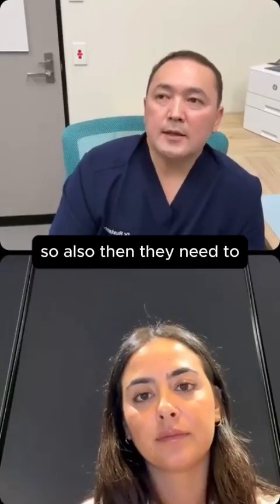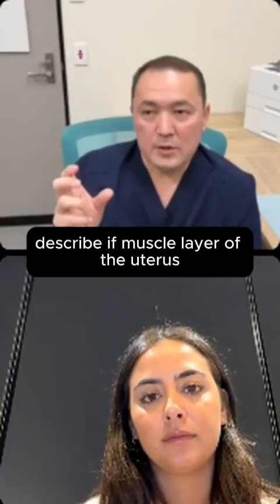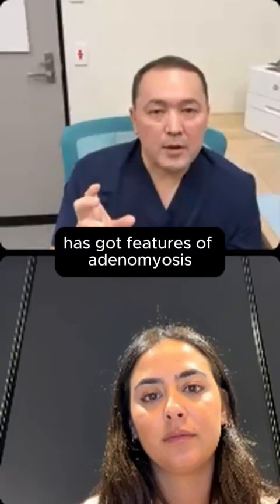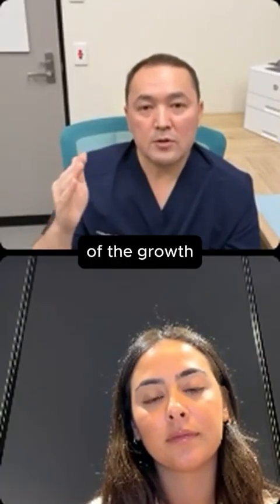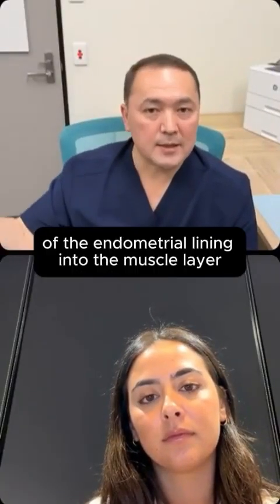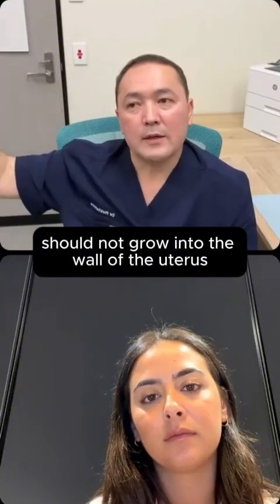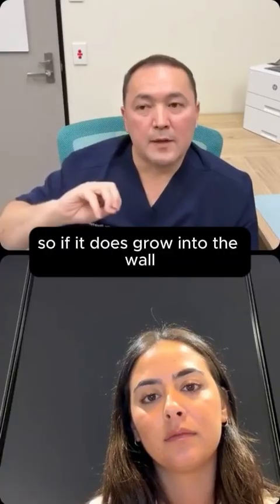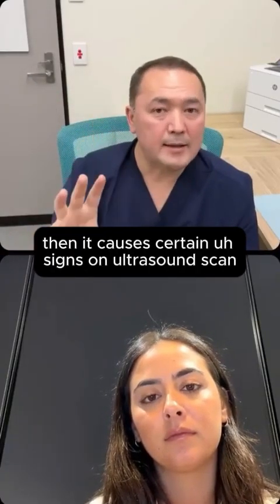So also then they need to describe if the muscle layer of the uterus has got features of adenomyosis. Adenomyosis is, by definition, the growth of the endometrial lining into the muscle layer. The endometrium, which is the lining of the uterus, should not grow into the wall of the uterus. So if it does grow into the wall, then it causes certain signs on ultrasound scan.